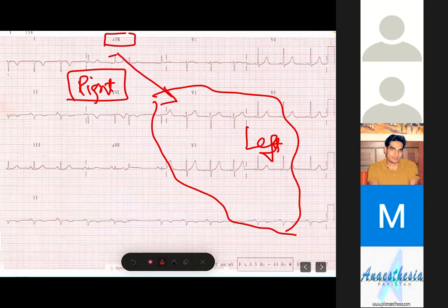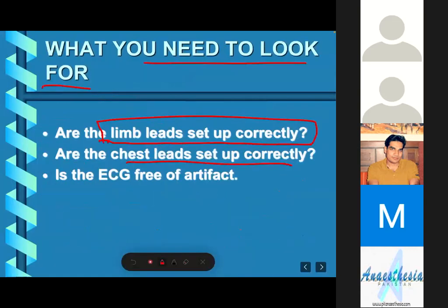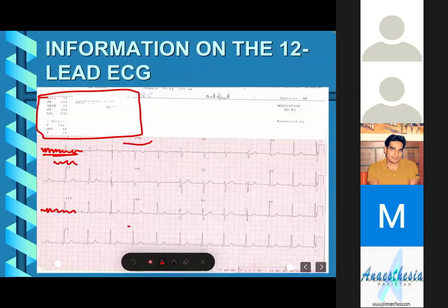In a normal ECG like this one, all the deflections should be on the negative side in the AVR lead. It shows that the ECG is done with the correct electrode placement. The QRS is a major downward deflection, the T wave is downward, and the P wave is downward. T wave, P wave, and QRS are all downward in AVR.